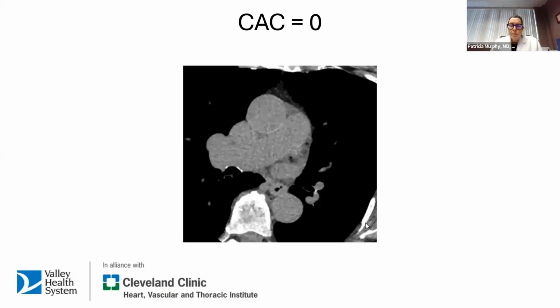So I'm going to show you some pictures now of a coronary CT calcium score. This one is a score of 0, I believe. I don't see my own caption, but all right. Okay, I'm going to play it for you.